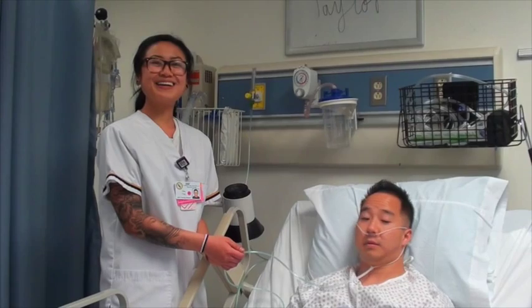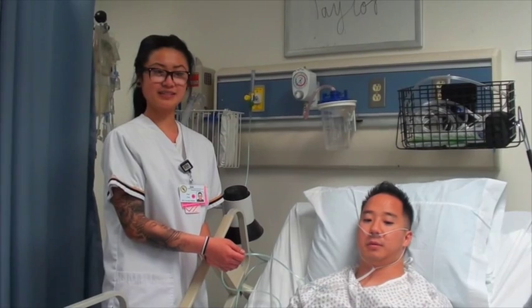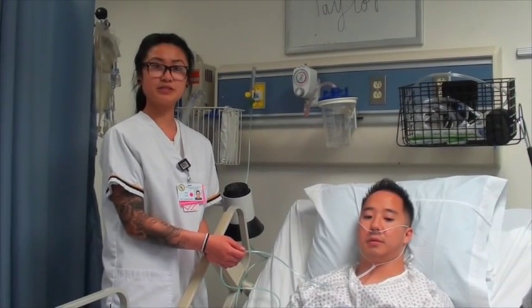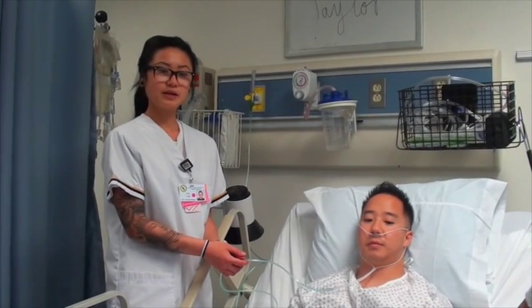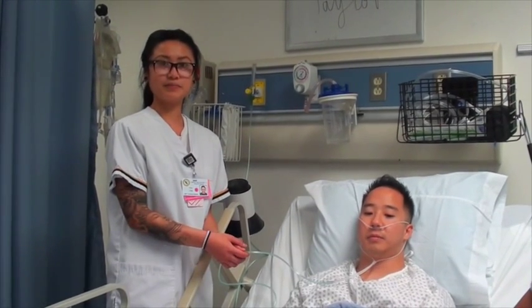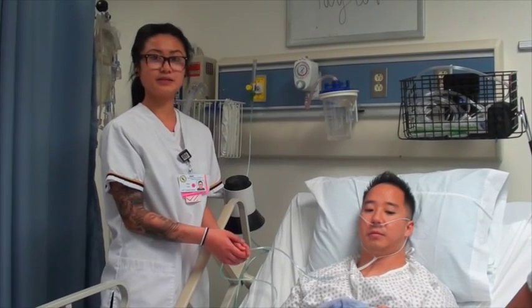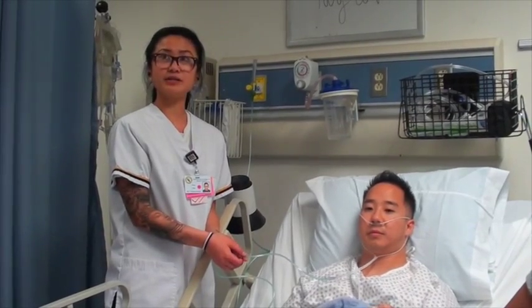Patients with COPD become dependent on a state of hypercapnia and hypoxia to stimulate the breathing reflex. So if the patient receives too much O2, then it could decrease or stop the patient's breathing reflexes. Also, as a nurse, you always want to assess the patient's response to therapy and also adjust the flow rate if needed. You might also want to assess the patient's nares and the patient's ears just to see if there's any skin breakdown, because for older patients, their skin is thinner and more fragile, so they're more susceptible to breakdowns.